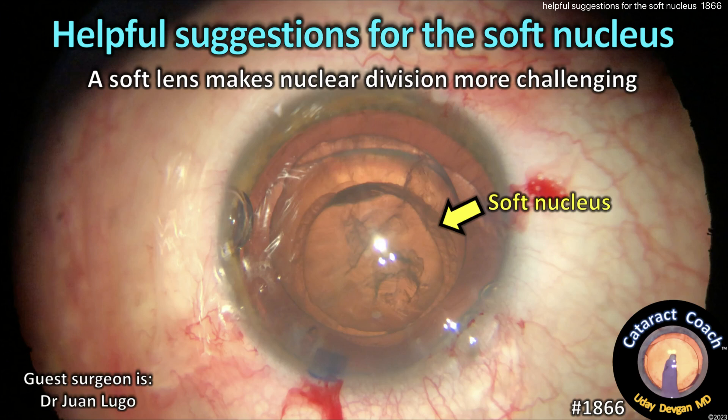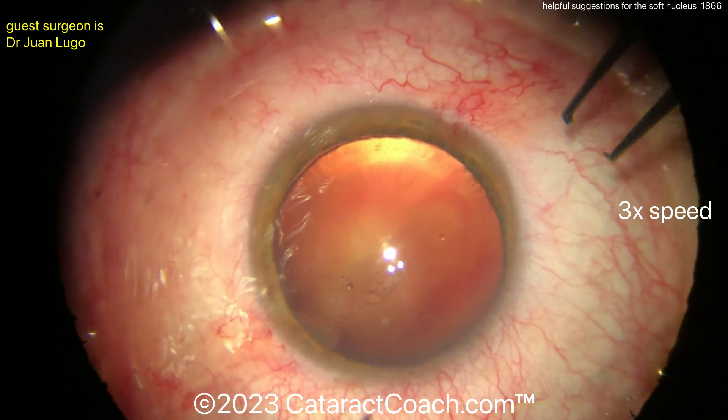CataractCoach.com — helpful suggestions for the soft nucleus, because sometimes a soft lens can be tough to split apart. Let's watch the video here.